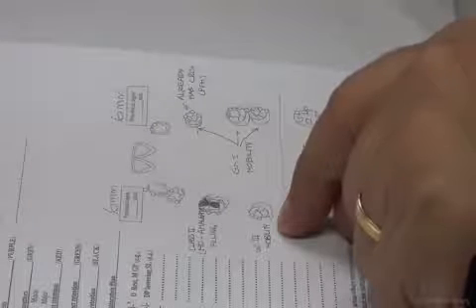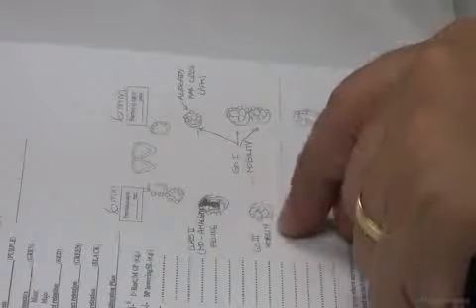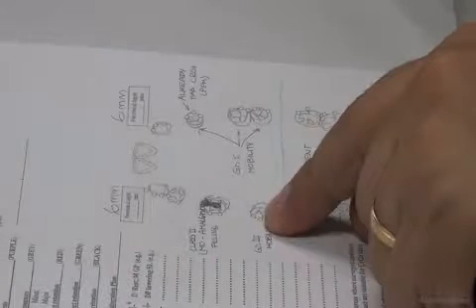That means it's for extraction. That means I have a saddle area now here. It became class 2 mod 5. Okay? Now if I say the lower 7 is also not present, am I going to replace the 7? No. Therefore I'm left with 5 bounded saddles. It becomes class 3 mod.